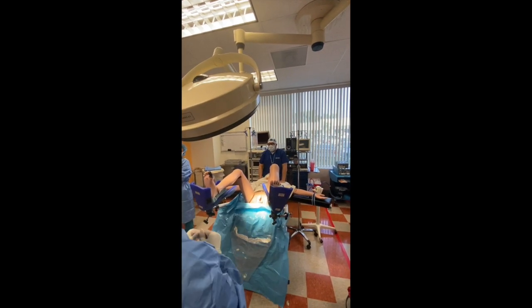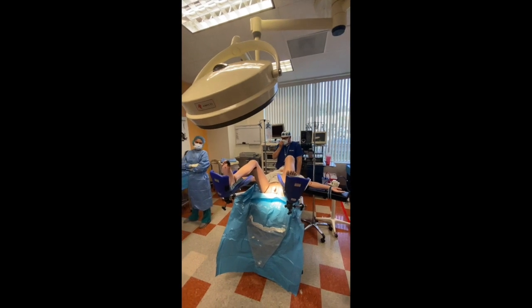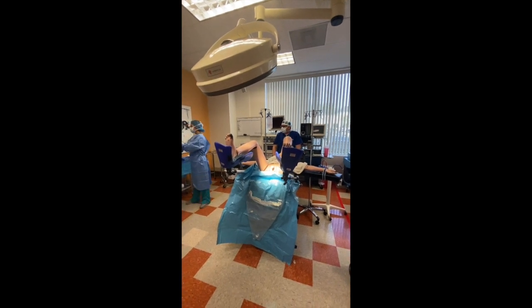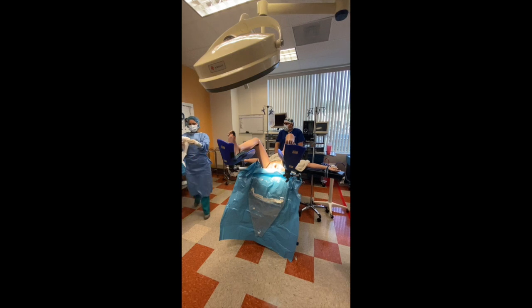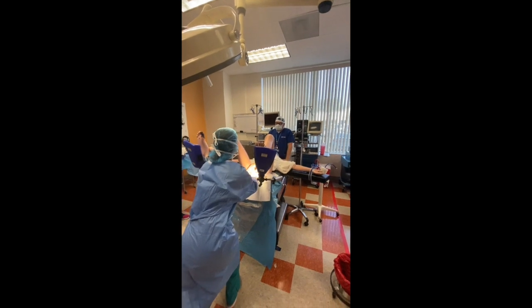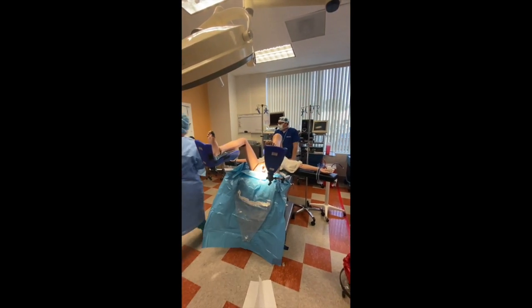Right arm's contaminated — we need a sleeve. Sleeve on. Apply adhesive towels across the perineum and midway between the vulva and anus. Here is our 1,000 drape between the penis and the anus.